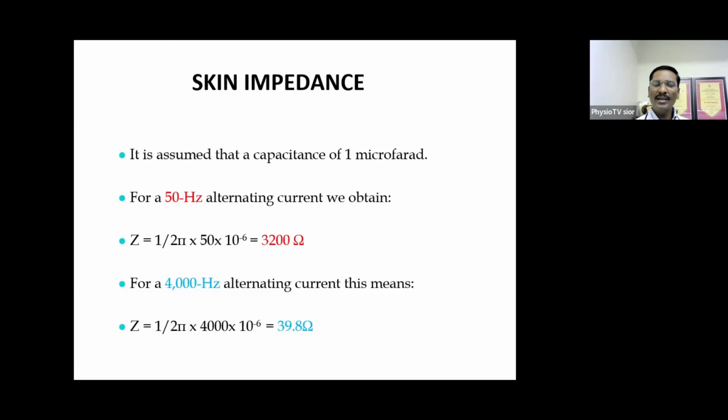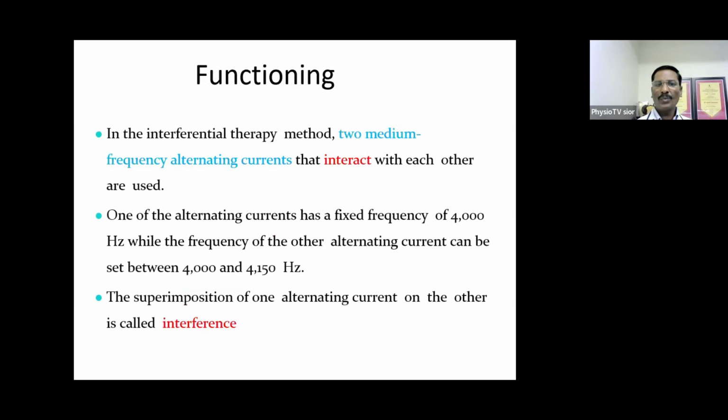So just understand how much less the skin is offering resistance to the medium frequency current when it is compared to the low frequency current. So that is the reason. This reason has led to the discovery of the IFT. This is the basis for the IFT.